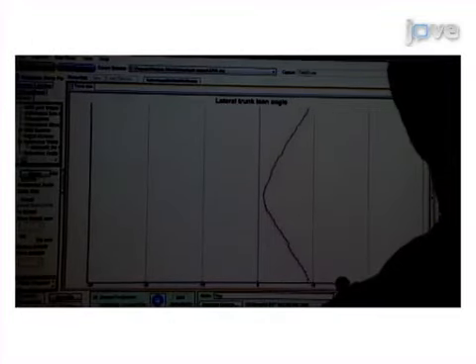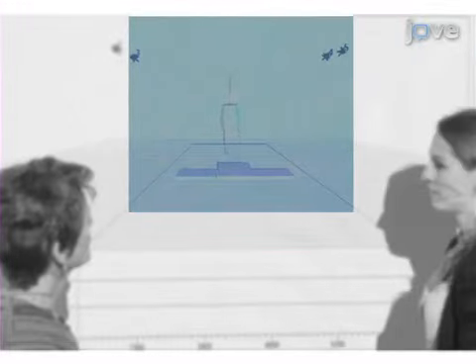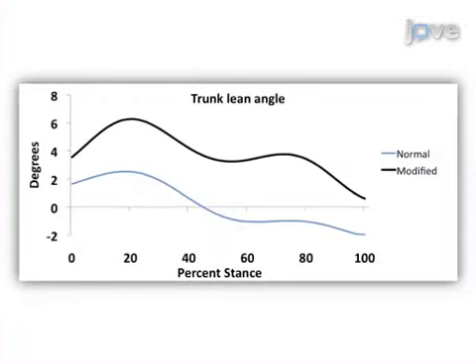Next, movement modification trials are conducted, which involves displaying real-time movement data in conjunction with a target depicting the amount of change to be achieved. The final step is to determine the effectiveness of the modified movement based on predetermined outcomes, and plan for subsequent sessions if appropriate. Ultimately, real-time movement modification is used to provide a quick and accurate method of changing movement parameters.